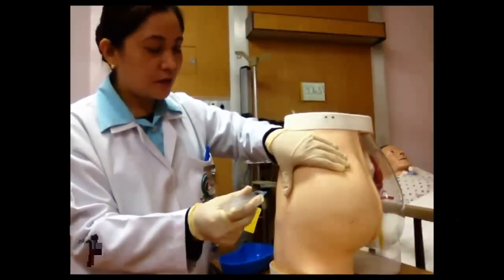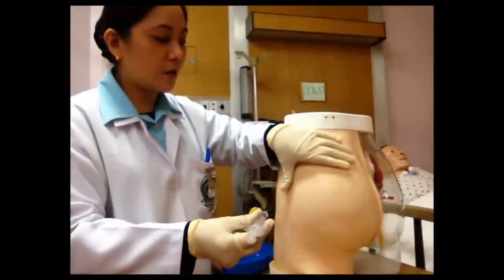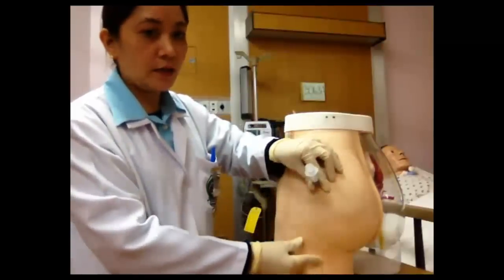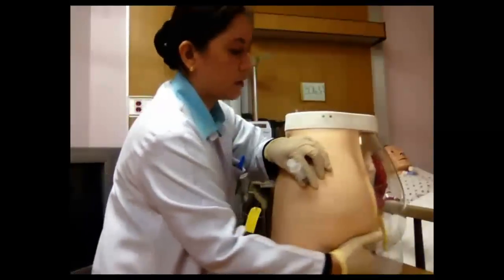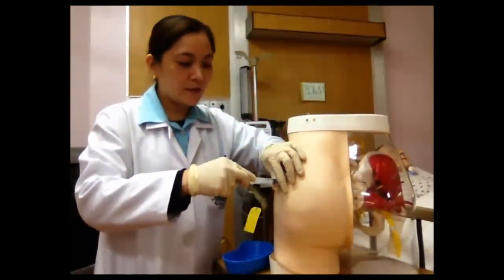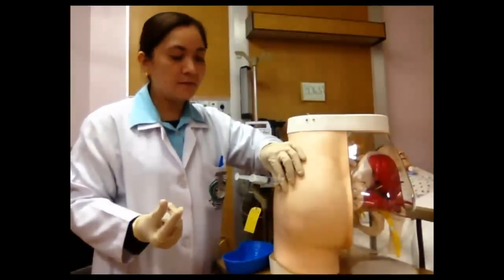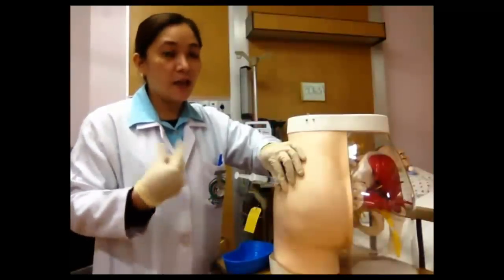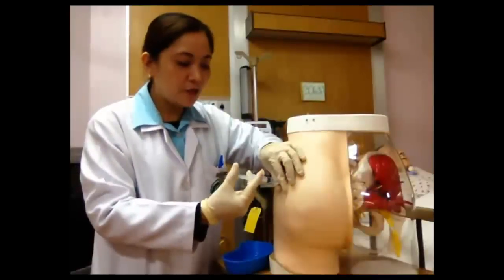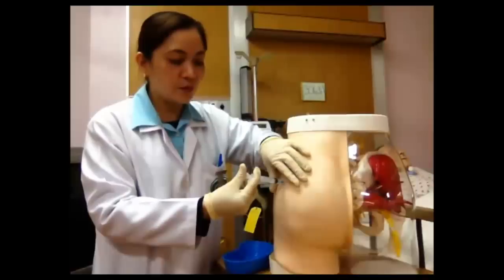Pinch the muscle of the patient. Inject the medication in a quick and dart manner. Okay, hold it. I want to show you clearly. And then aspirate. If there is any blood, then withdraw the needle and change the medication. But if there is no blood, meaning you did not hit any vein, then you can slowly push or inject the medication to your patient.